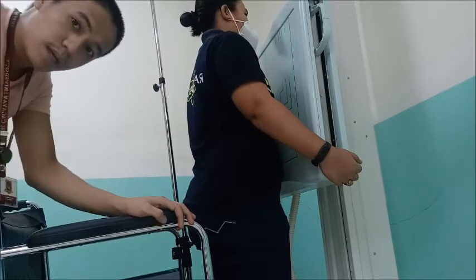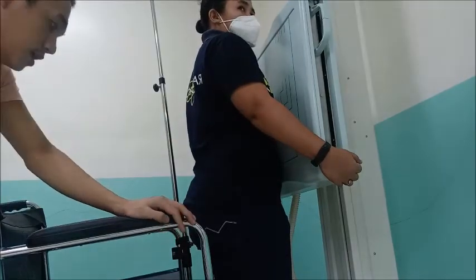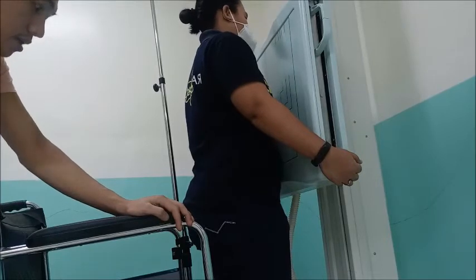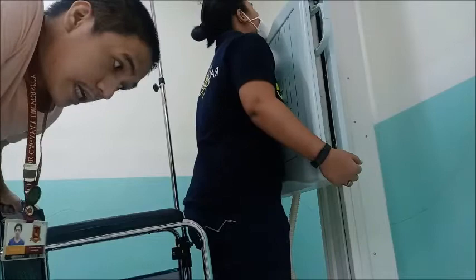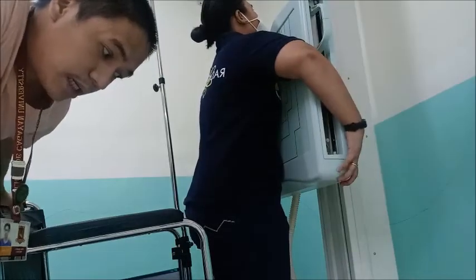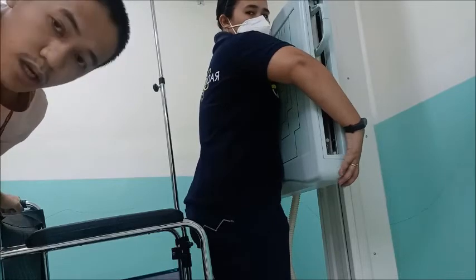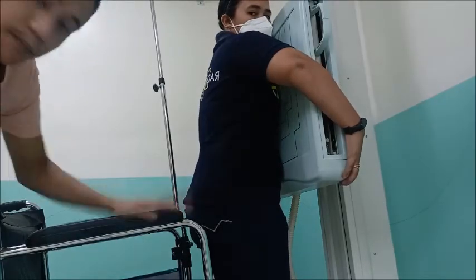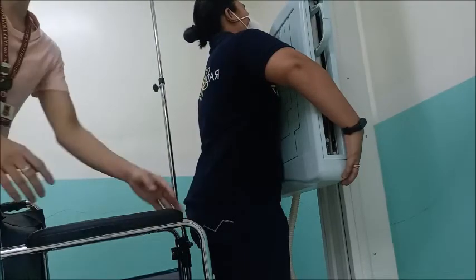So, pwede nga nakalingkod lang, also pwede pa siya nga nakatindog. So, again, if your patient is standing up, tapos naka-wheelchair siya, and then the patient is not feeling well, if ever malipong si patient, natumba siya kalit, at least the wheelchair is in place to catch the patient.